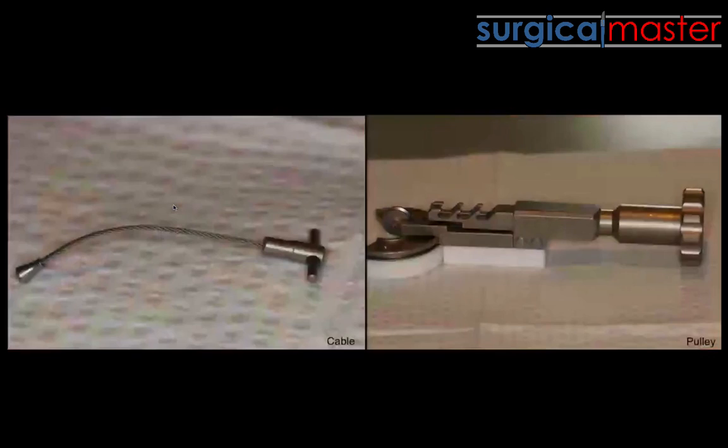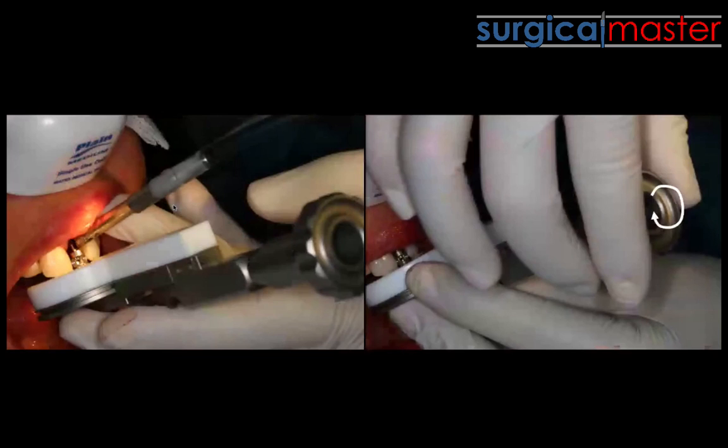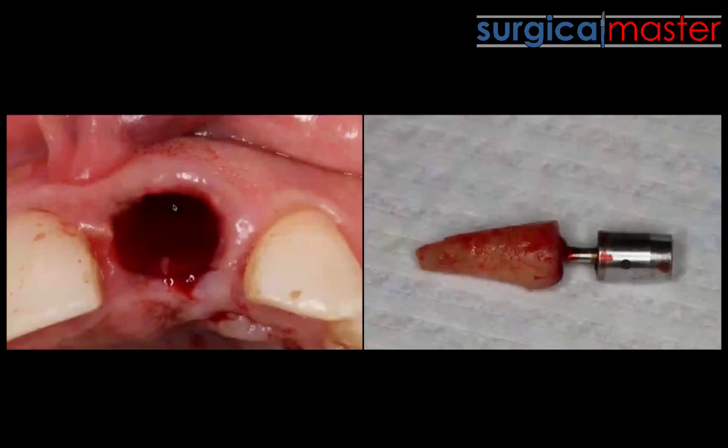Once you have this extraction screw, you connect a cable to it and a pulley system that connects to the cable. This pulley system has a bumper — seen here in white — that has to be placed perpendicular to the root. By rotating a knob in a clockwise direction, that applies a pull on the cable, which pulls on the extraction screw, which pulls on the root.